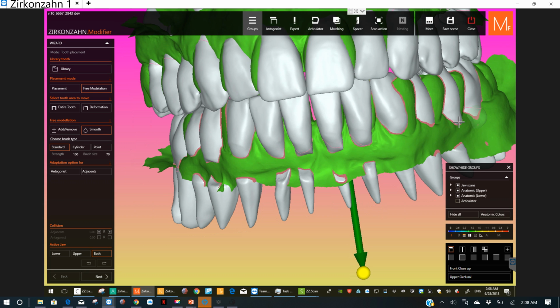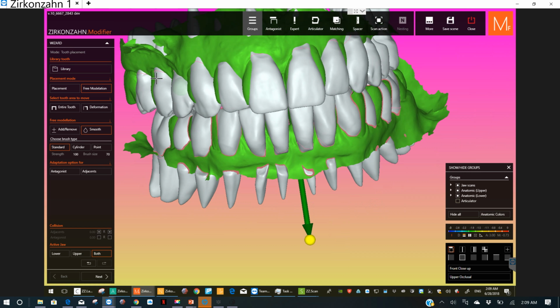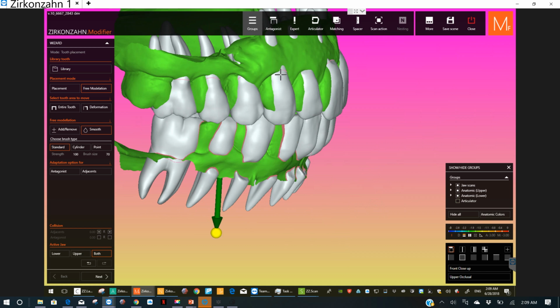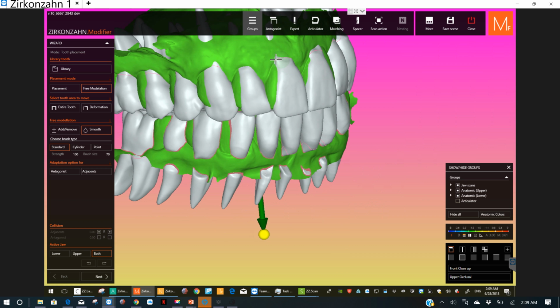So and we don't have to mill or put in surgical bridges. But we do have to do nice try-ins. But that's fun, they're not in pain, they're not sore, they're still in happy mode. It's an exciting part to think about what kind of facial changes you could get. If their smile is kind of coming up weird or crooked on one side, it probably needs a little material somewhere.